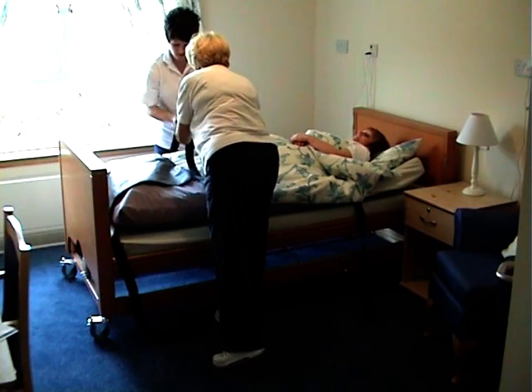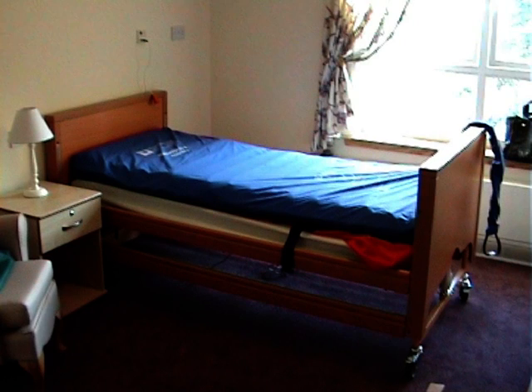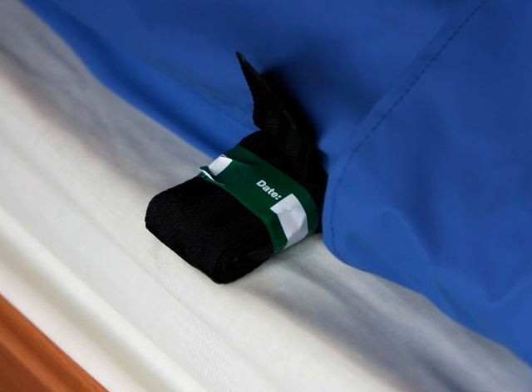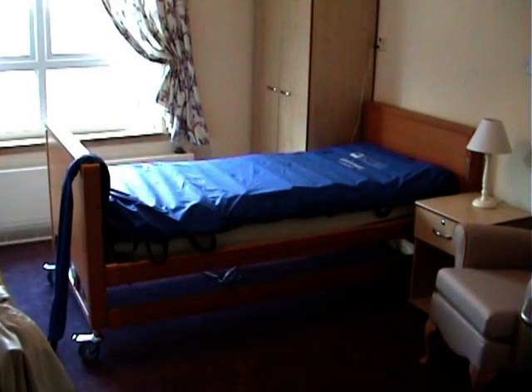These also should have been signed and dated. The same applies for a hospital bed. Bedroom 3 has an airflow mattress with a red fire evacuation underlay below it in preparation for use. Note the strap labels, which again should be checked every week. These should be signed and dated.